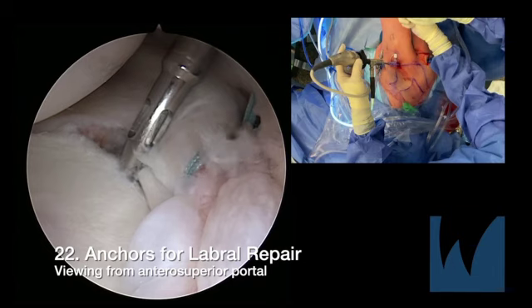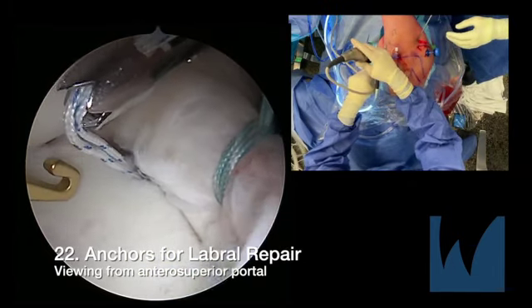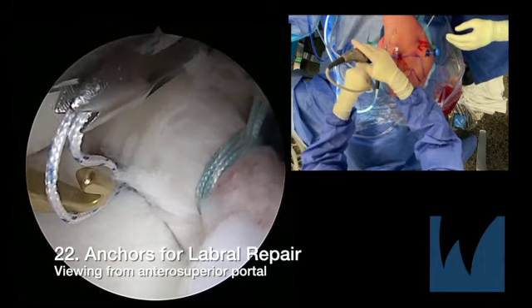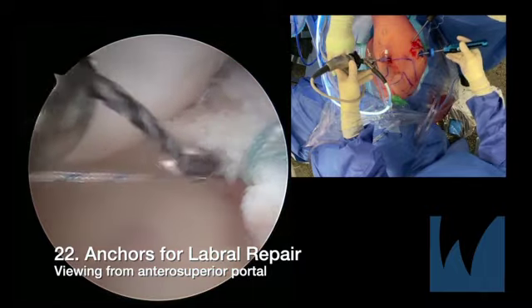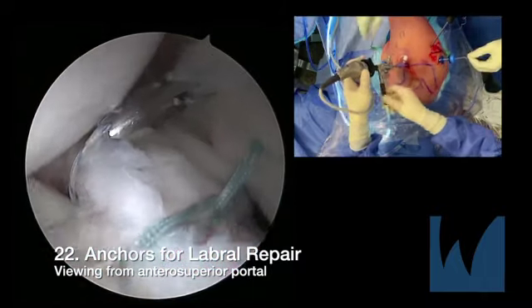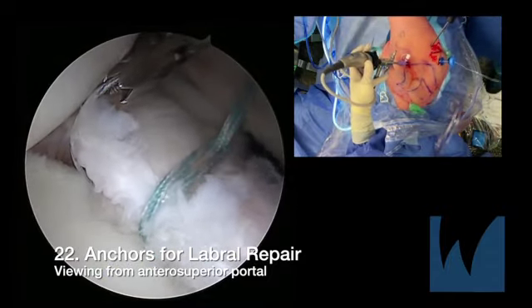Set the anchors on the native glenoid, not the distal tibia allograft. This allows the glenoid labrum to be repositioned anatomically to the posterior glenoid face, similar to a posterior Bankart repair, over the top of the graft posteriorly. This reattachment of the capsulolabral complex keeps the graft extra-articular.